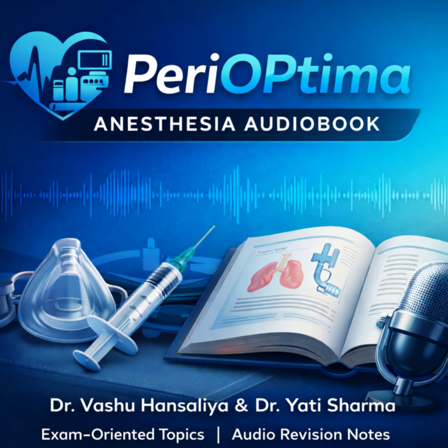Exactly. The IABP reduces aortic afterload with that systolic unloading. It lowers the resistance in the forward path, which is the aorta, so more blood goes out the aorta and less goes back into the atrium. So it reduces the regurgitant fraction. Precisely. It doesn't fix the hole, but it improves the forward flow. It acts as a crucial bridge to definitive surgical repair. That makes perfect sense. Any other indications worth mentioning?